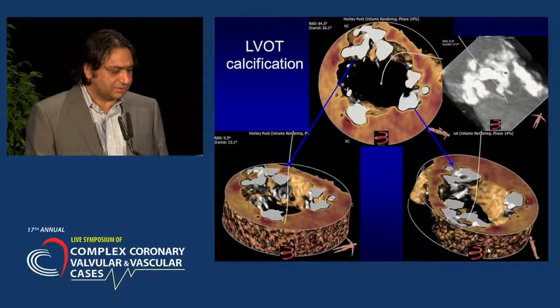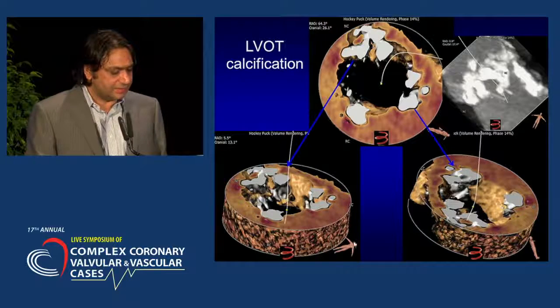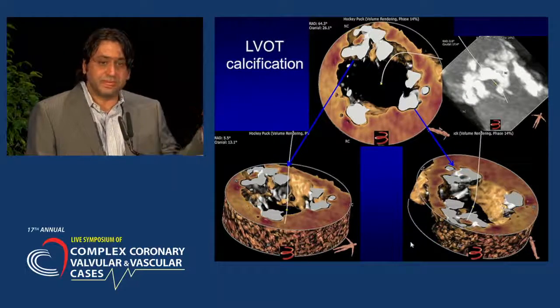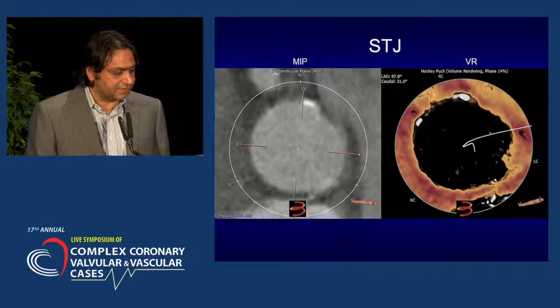We went back and we looked at the calcium. Once again, look at the LVOT calcium. This patient did just fine, went home in 2 days. And so contained hematomas have a completely different outcome. In fact, none of the patients in the series that I showed you actually had any bad outcomes if it was a contained hematoma, of course, compared to rupture, where the mortality is very, very high.